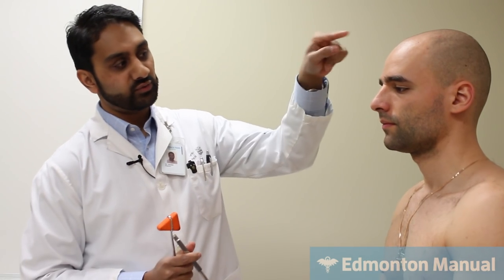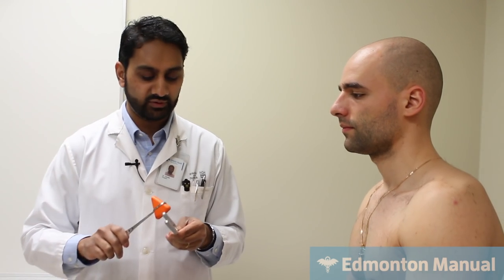So there's two tests you can do. Weber's test is placing the tuning fork in the middle of the forehead and trying to see if it localizes to one side or the other. We're going to pretend that this patient has a problem with their left ear to orient us to what is happening. So I'm going to strike the tuning fork and put it on the middle of his forehead.